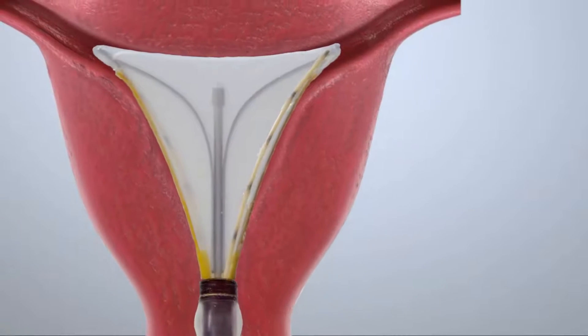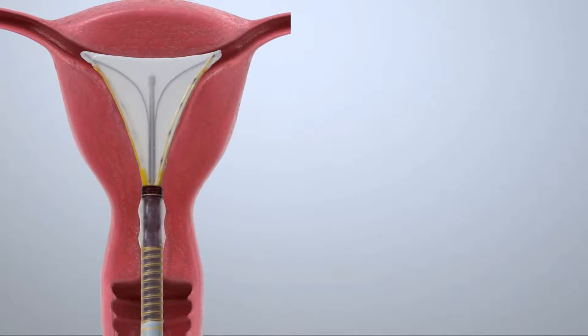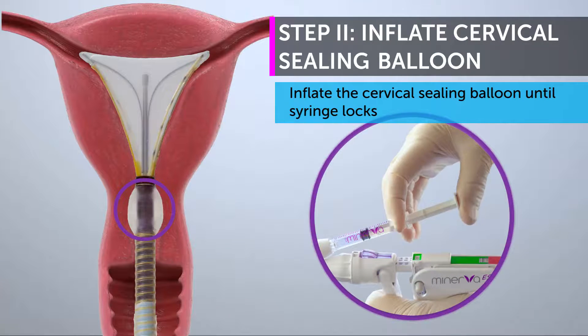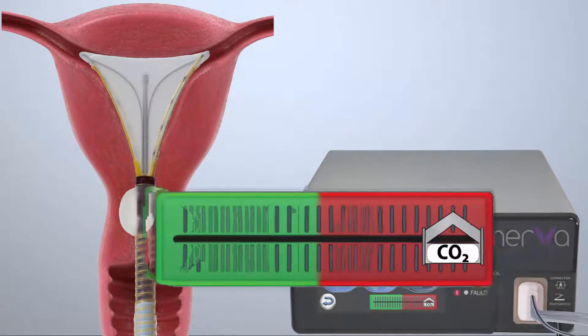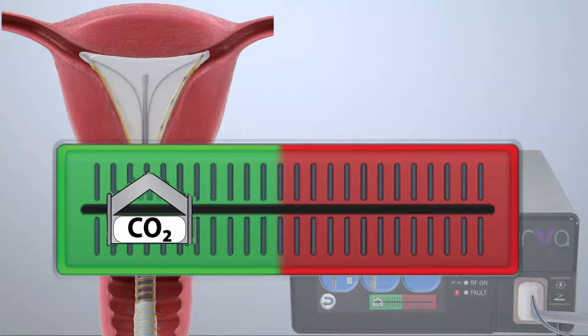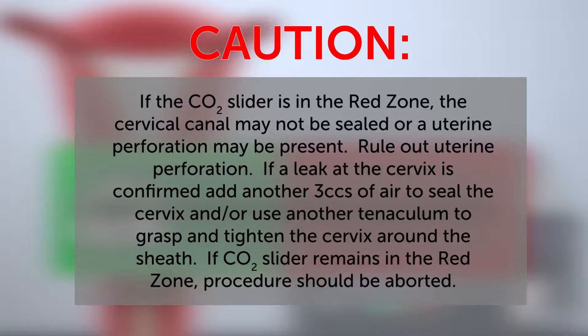In addition, maintain slight traction on the tenaculum to ensure the array is against the fundus. Inflate the cervical sealing balloon until the syringe locks. When the cervical canal is sealed, the CO2 slider on the controller will move into the green zone. If the CO2 slider is in the red zone, the cervical canal may not be sealed or a uterine perforation may be present.